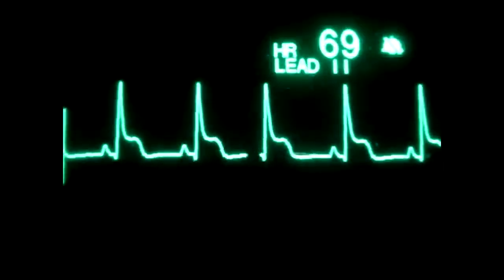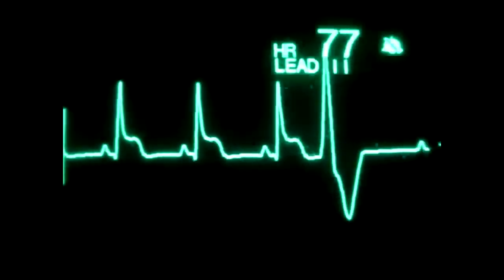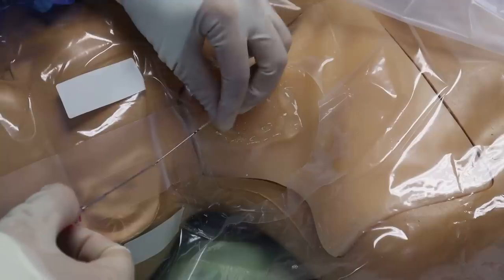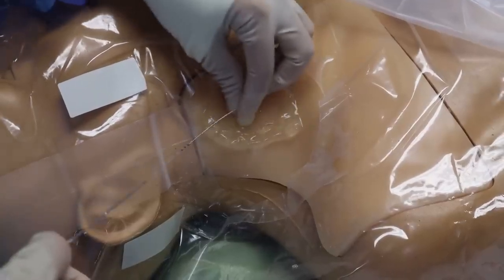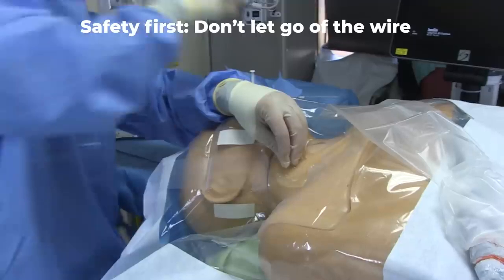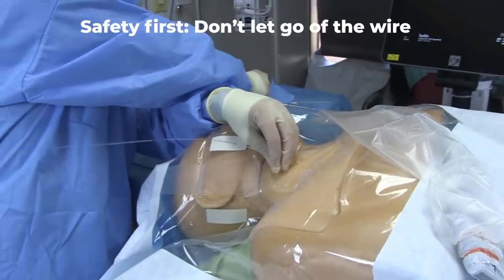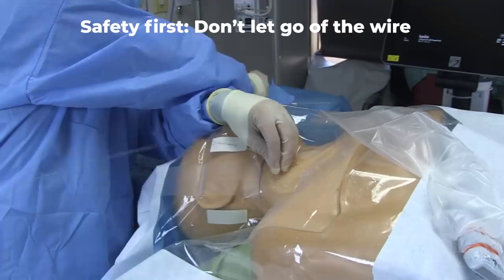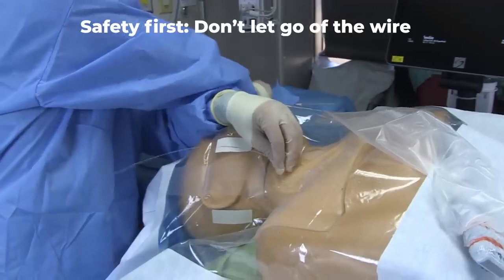And as you advance, watch the monitors for signs of ectopy. If you see that, then you are too deep and you should withdraw the wire a couple centimeters. From here on out, one hand should always be controlling the wire until it is out of the body. Otherwise, there is the rare chance it gets totally sucked into the vein and that will be an embarrassing call to vascular or cardiothoracic surgery.